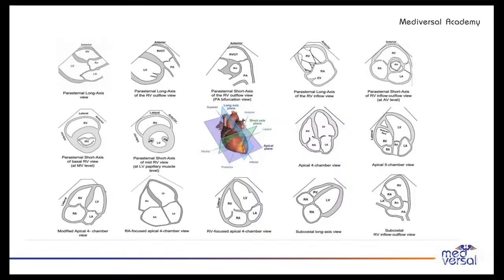Is RV wall thickness helpful in RV failure? Generally, no.